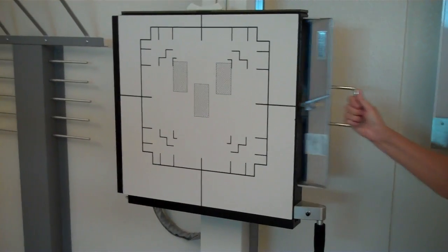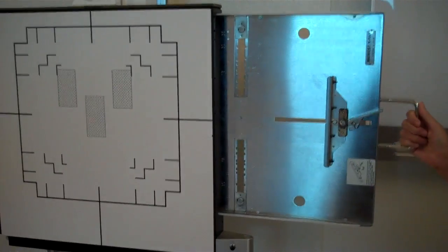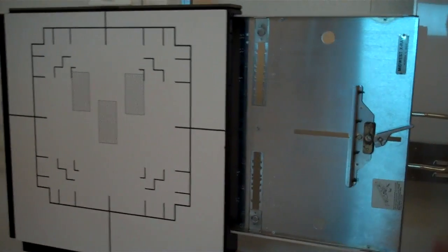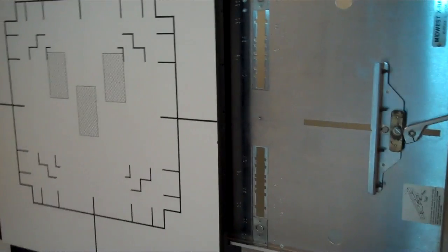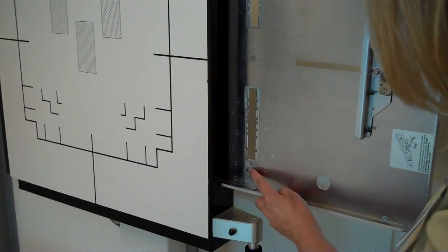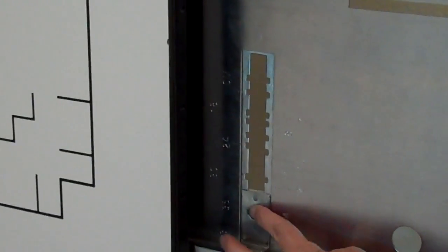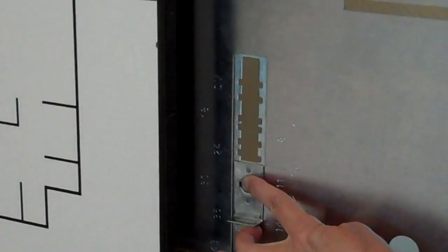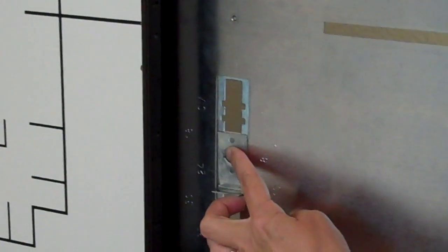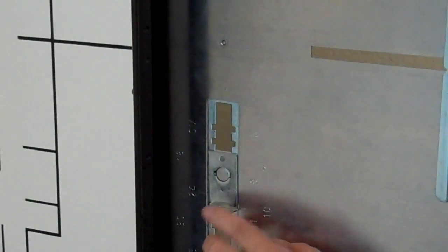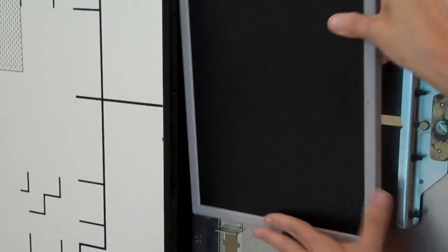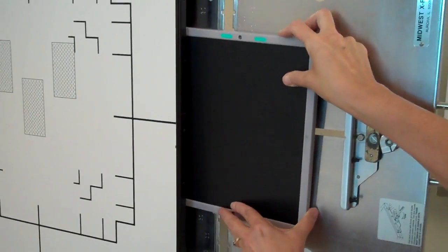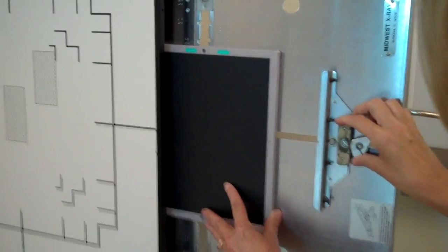Pull the bucky tray out. To help hold the image receptor in place, push the button in the center for this bottom tray lever to move. And you'll be able to hold your image receptor in place.